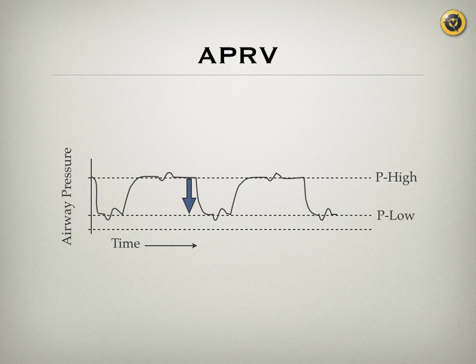That means you're also decreasing the excursion. Remember when we said the lung that is ventilated by 10 of PEEP and 45 of peak pressure was better than the lung that was ventilated by 0 and 45. And this applies here because now the lung is expanded, and it doesn't really shrink all the way and come back expanded. So the shear forces on the lung are less, and hence less destruction of normal lung elements.